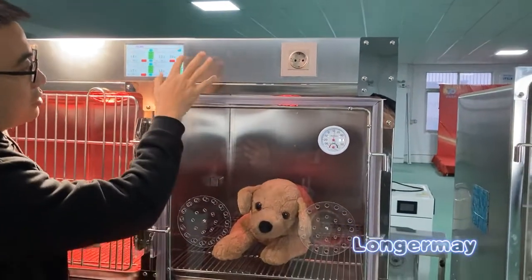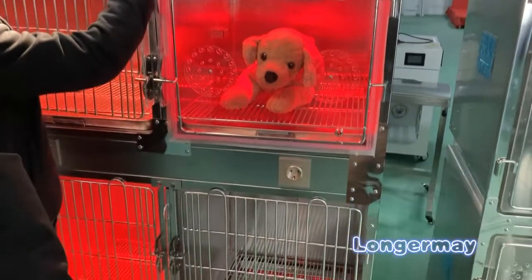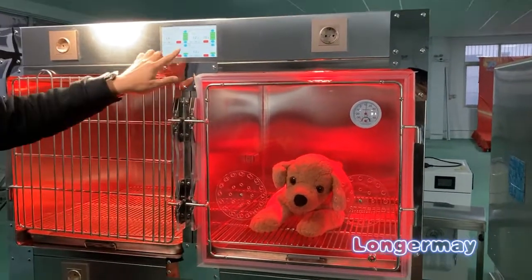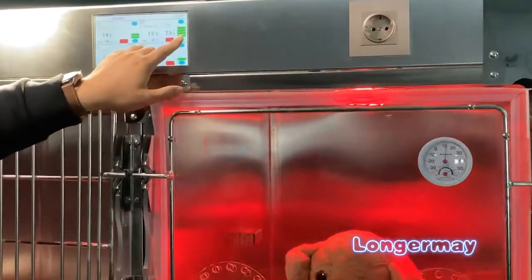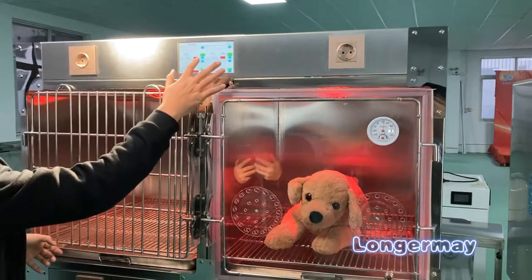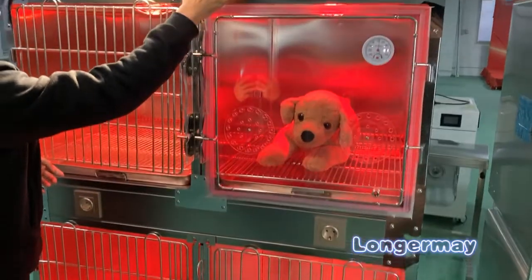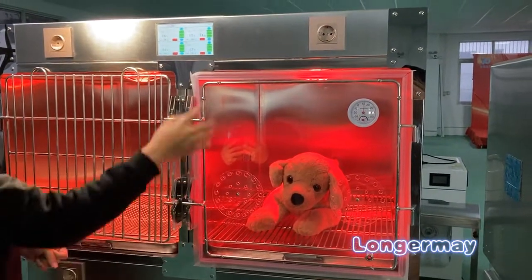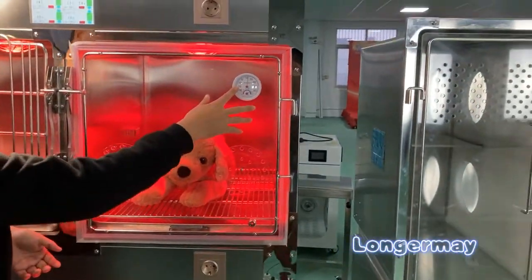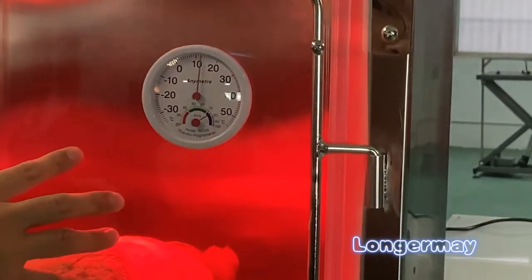The light also can be adjusted, you see, for different doors. The chamber light is adjustable. This one also adjusts the arch. And it also shows the temperature and the humidity of the chamber.